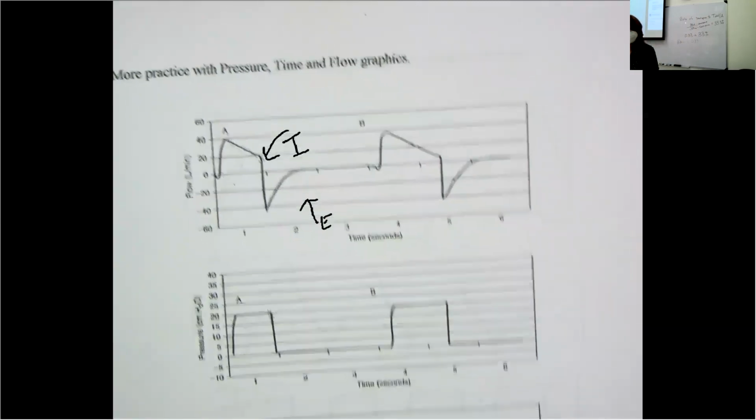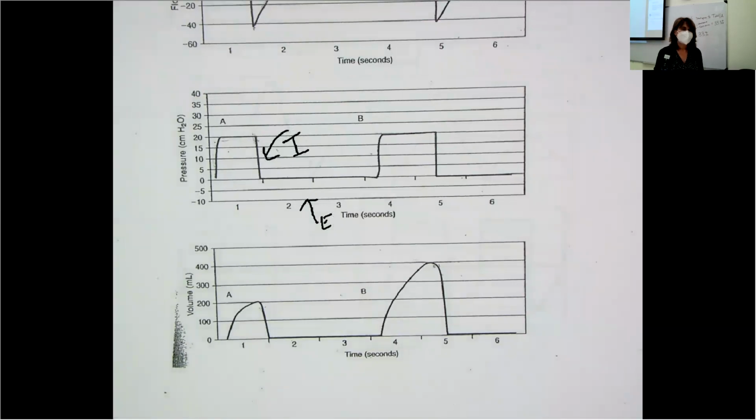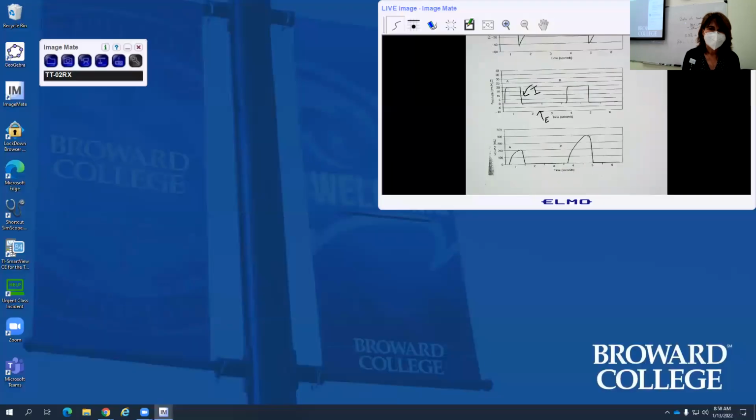Okay, the next graphic, which one is inspiration and which one is exhalation? Do I clear it? No. All 3 of these are from the same breath.